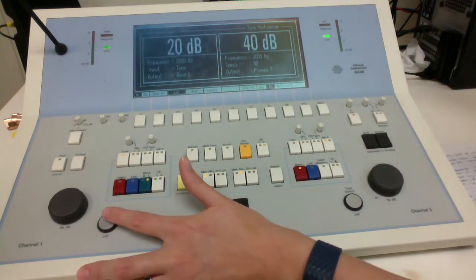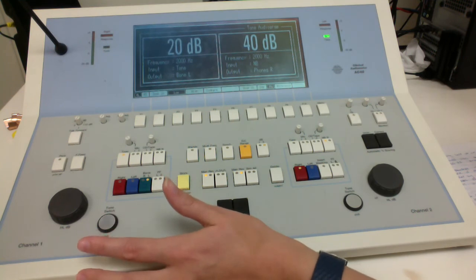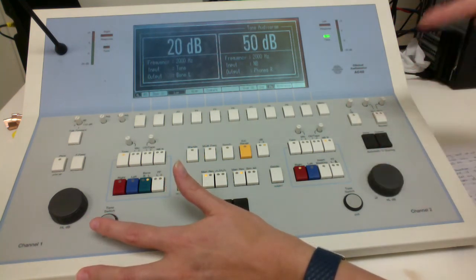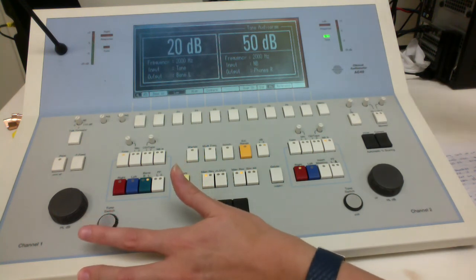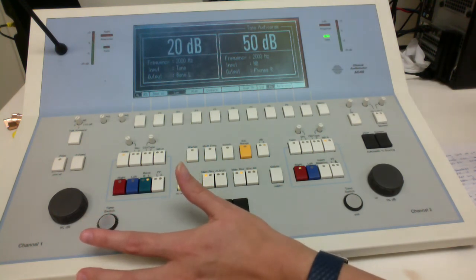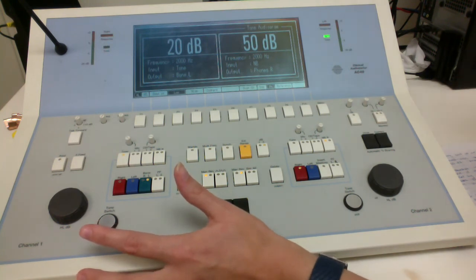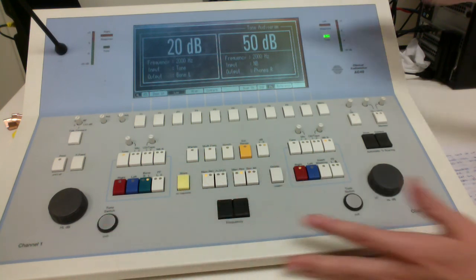So you'd increase it up to 40, and then if they respond again, increase it again to 50. If they responded there, then we could stop and take 20 dB as our masked bone conduction threshold of the left ear at 2000 hertz, and the effective masking level would be 50.